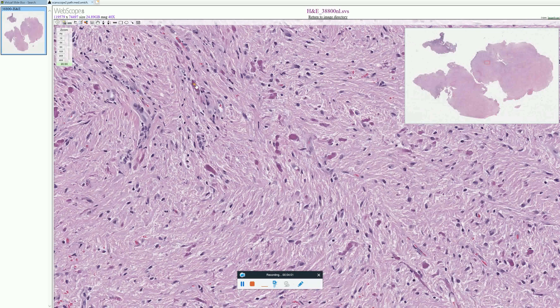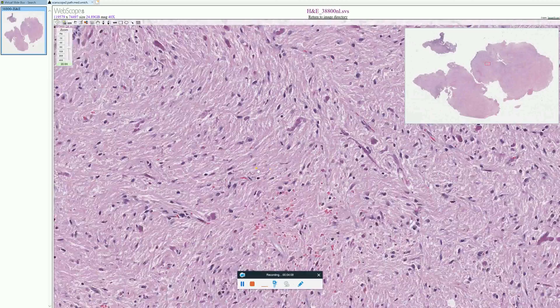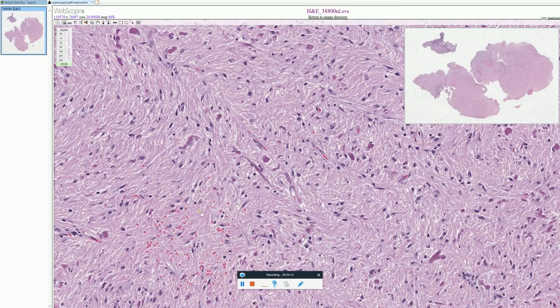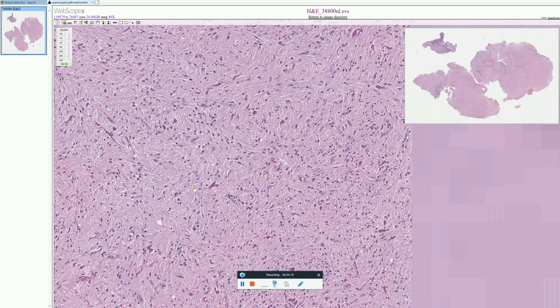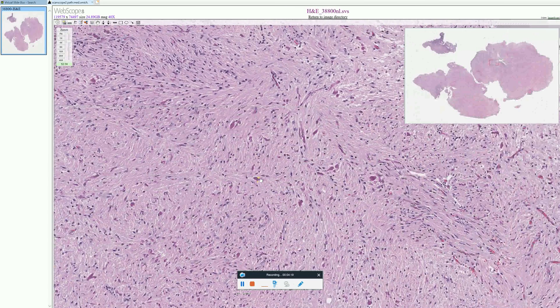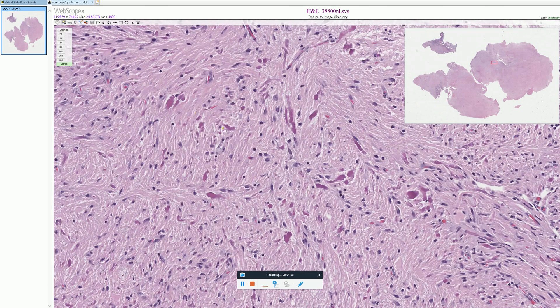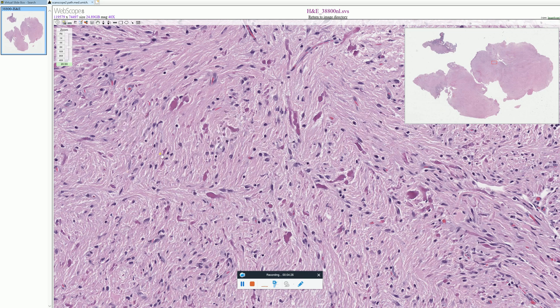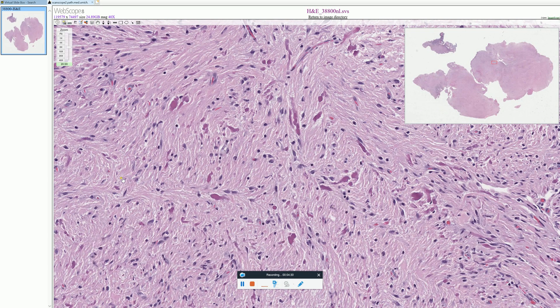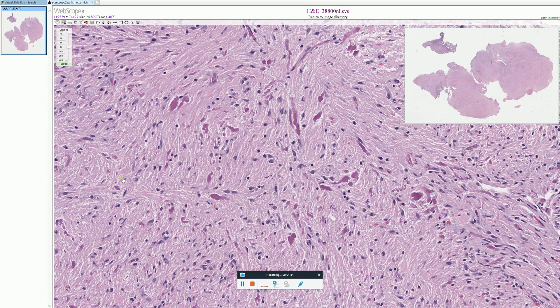Whenever you see a Rosenthal fiber — these kind of purple-pink structures — this should make you think of pilocytic astrocytoma. However, they're not specific for pilocytic astrocytoma. You can find Rosenthal fibers in a variety of other lesions, particularly if you have a slow-growing tumor growing next to non-neoplastic brain. You can get Rosenthal fibers in the non-neoplastic brain immediately surrounding a slow-growing tumor, such as a craniopharyngioma, hemangioblastoma, or meningioma, as a reactive process.